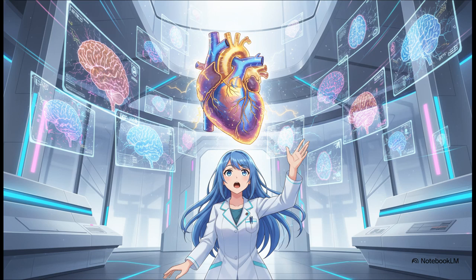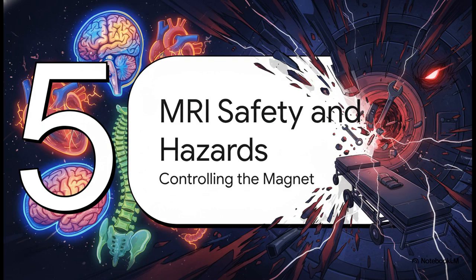We're talking techniques like fast spin echo, which uses an entire train of 180-degree pulses, and ultrafast Echo-Planar Imaging, or EPI. These have fundamentally changed the game, dropping standard brain scan times from 15 agonizing minutes to under 3. Meanwhile, sequences like steady-state free precession, or SSFP, use perfectly balanced gradients to maintain a steady state of magnetization. This gives us incredibly high signal-to-noise ratios and has completely revolutionized our ability to shoot real-time movies of the beating human heart. Finally, Section 5, MRI safety and hazards.